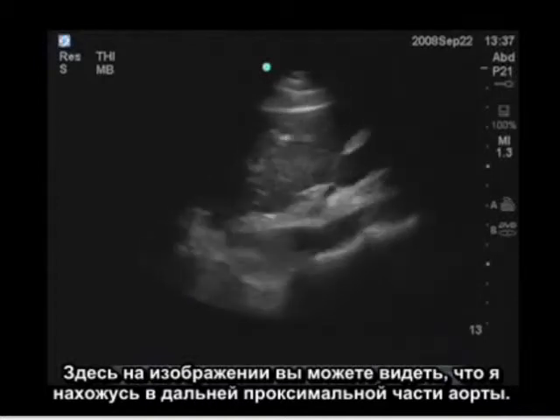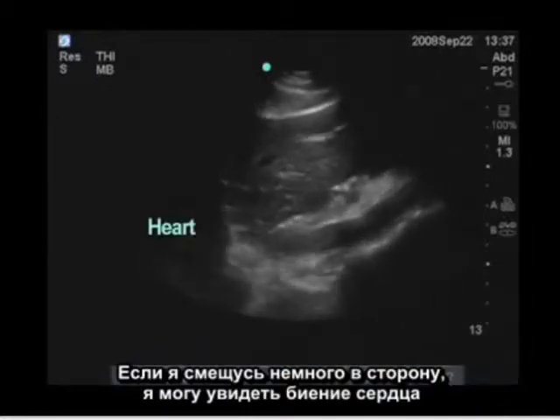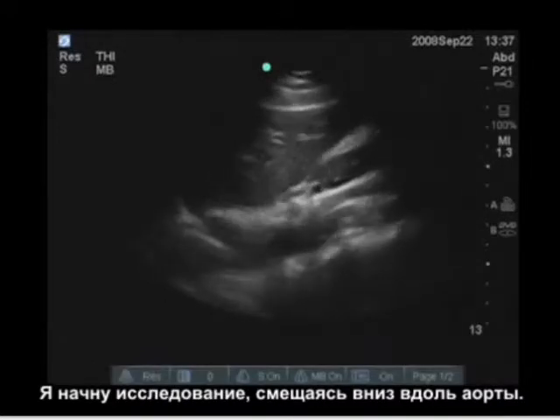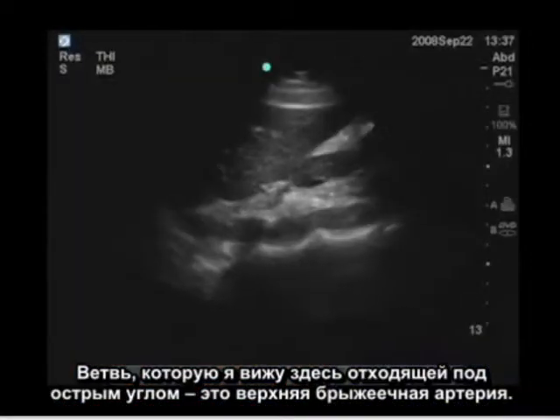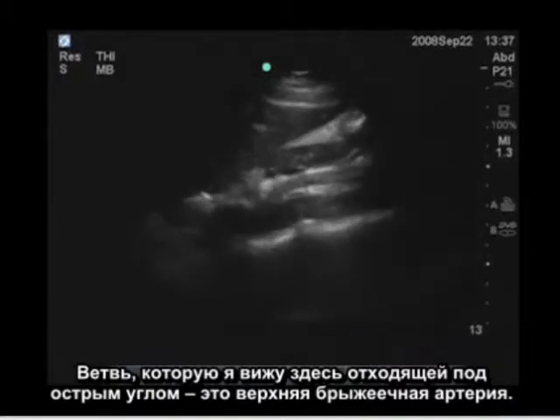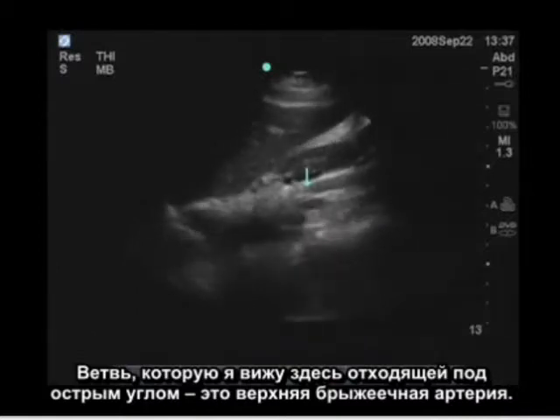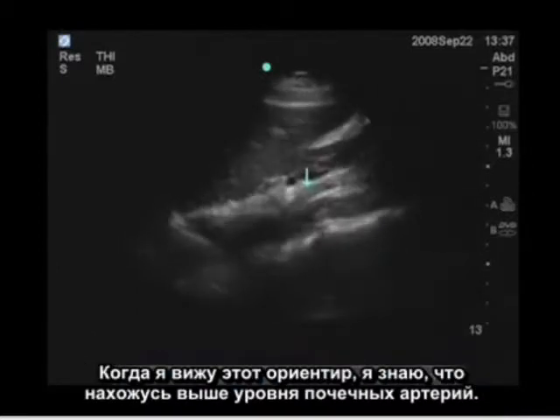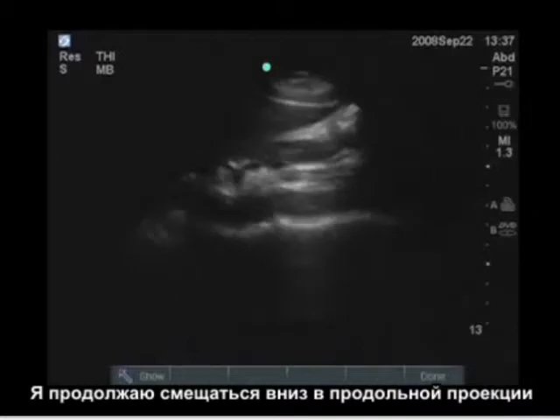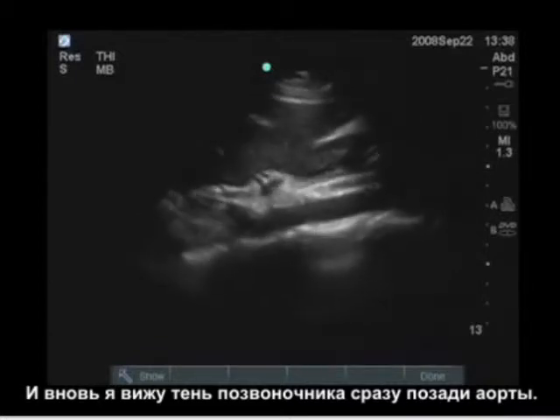Here in the image I'm in the very proximal portion of the aorta — we see the liver anterior to the aorta. Moving up slightly, I can see the heart beating just above the diaphragm, so I know I'm at the very proximal level. The branch coming off at a shallow angle is the superior mesenteric artery, which tells me I'm above the level of the renal arteries. I can also see the shadow of the spine directly posterior to the aorta.